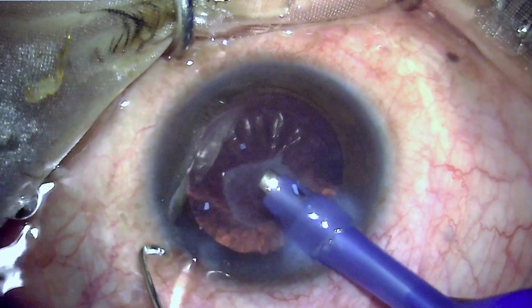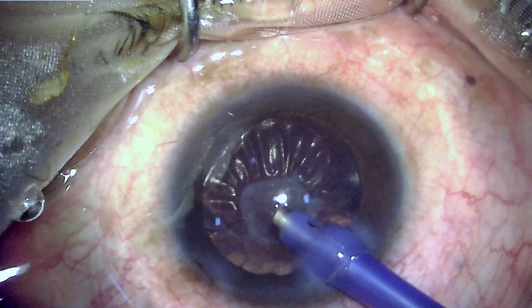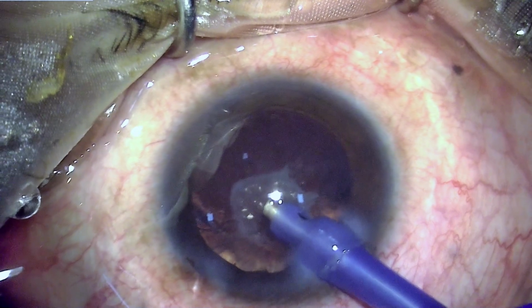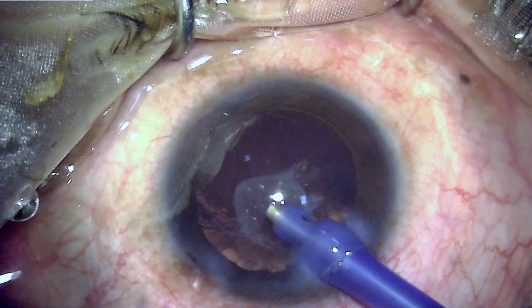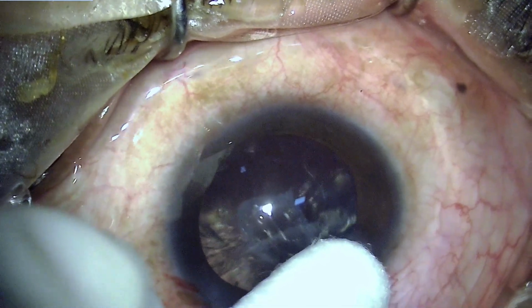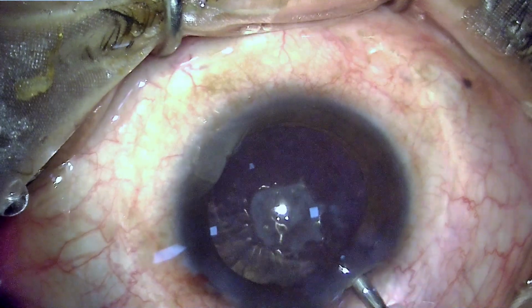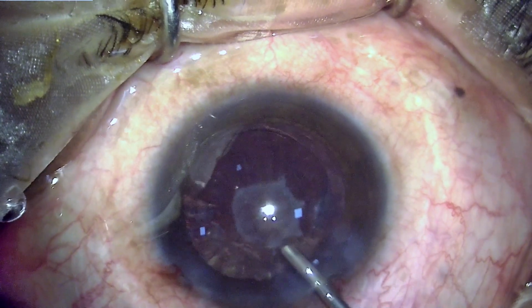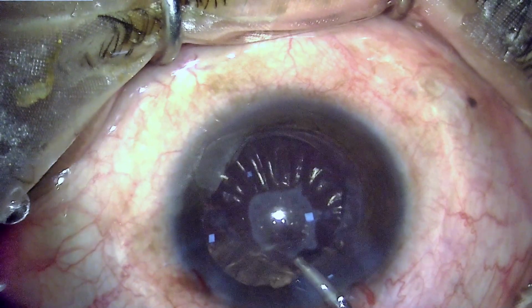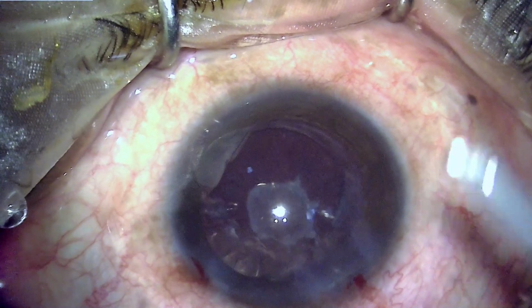And you will see that once exiting out of the anterior chamber, it's very important that one takes care of leakage in the anterior chamber, and one should always seal the wound immediately before removing the irrigation or any instrument occupying the main port. And this will prevent collapse of the anterior chamber, which can cause a significant pressure difference and pull up the silicone oil.